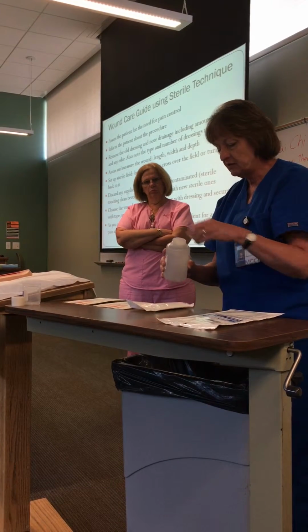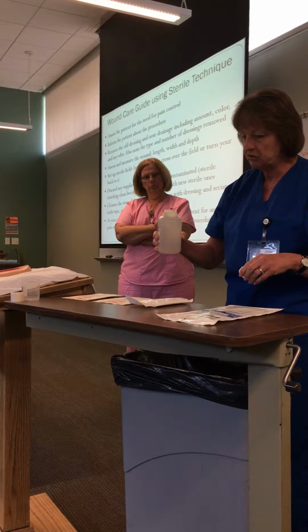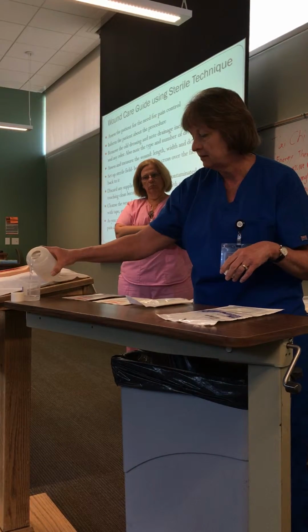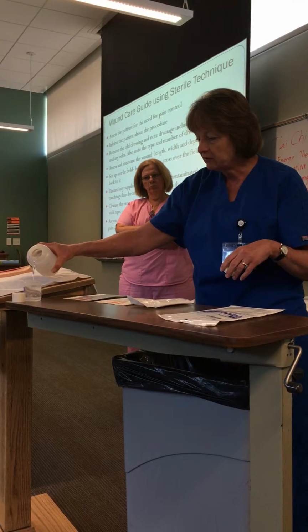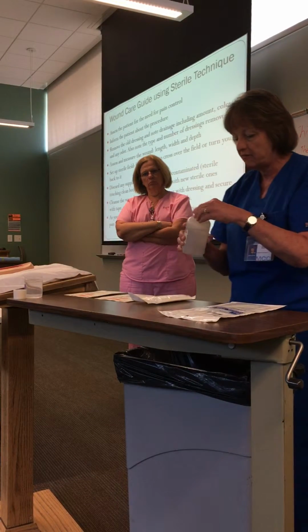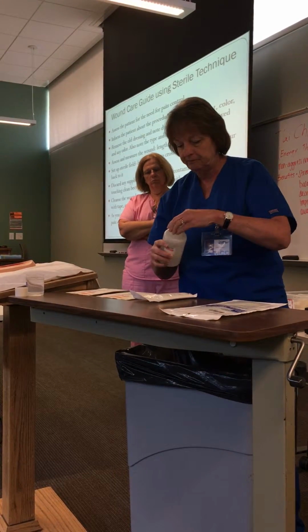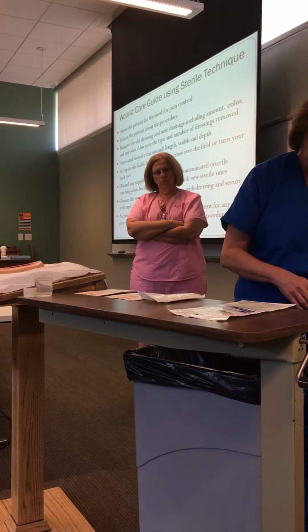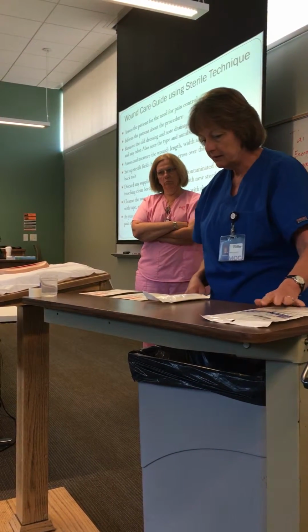And then we're still doing something we call lipping the solution, you guys. We're pouring off a little bit at the top in case there's anything hanging on there. Now I want you guys to fill it as full as you can, because it's a lot easier and you have less chance of contamination. So now I can put this off to the side. Now I have to create my sterile field.